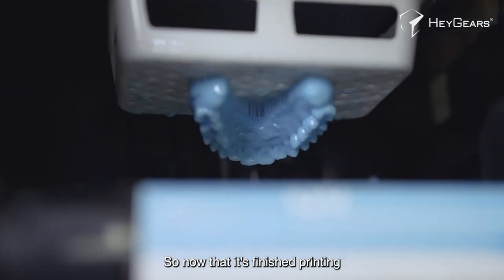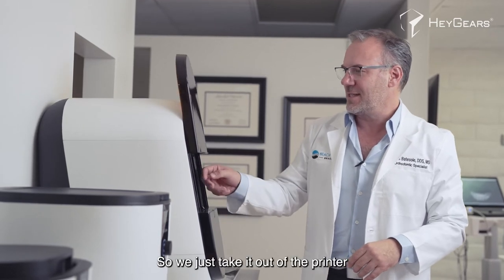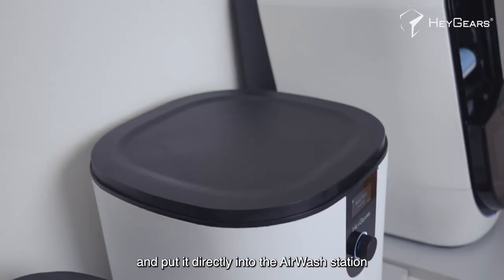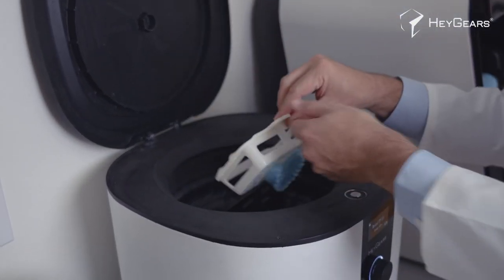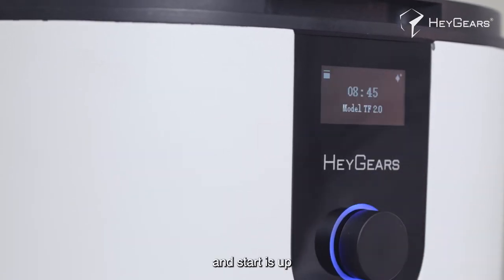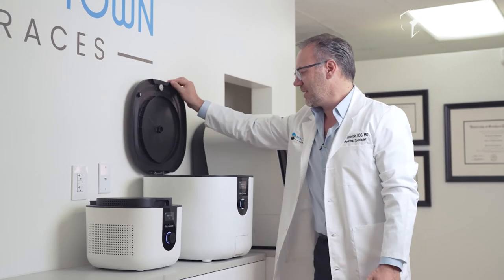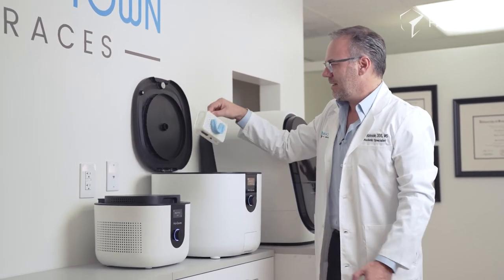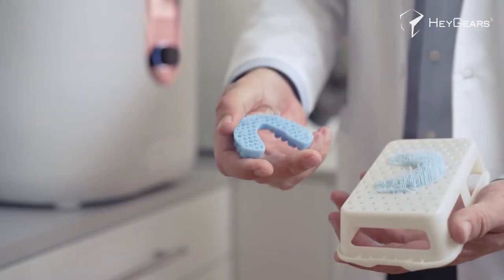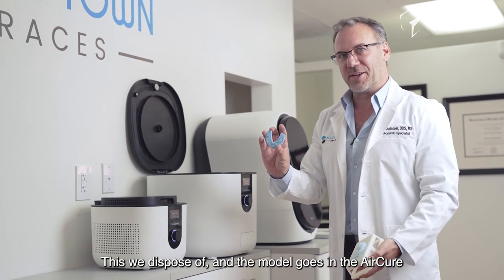Now that it's finished printing, the next step is to remove all the excess resin. We take it out of the printer and put it directly into the air wash station and start it up. Next we remove it from the wash, remove the model from the build platform like that. The build platform we dispose of, and the model goes in the air cure.